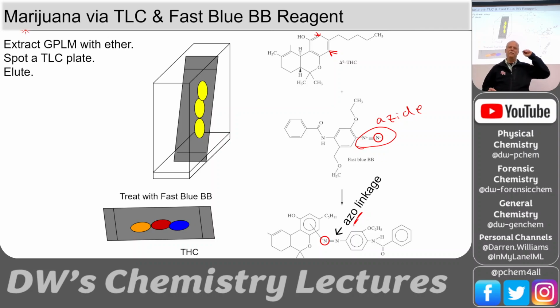So that's really the main point today, was to learn the 4 classifications of the different colorants, to add in a couple of inorganic ones, like the copper ammonia one for the propane tank and brass valve, and also the Simon-Awe complex that has the iron in it. And then to show you some of the ways that we draw these really complex reactions, like the wavy line in LSD, to sort of just eliminate half of the molecule, or this one, where they show a moiety, a chemical piece that's bonded somewhere on an aromatic ring. They'll just point to the ring.